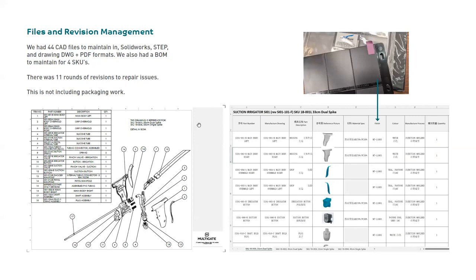There's a lot of work. And this doesn't even include the packaging, which was a whole extra thing again. But fun fact, the mold texture that we use on our device is the MT11003, which is the satin of mold textures. I think it's a really nice texture.